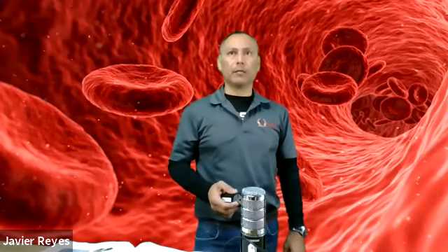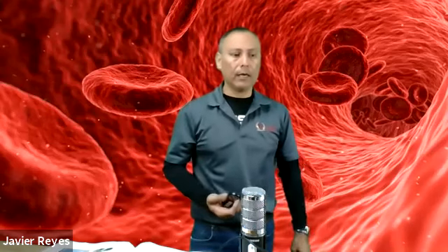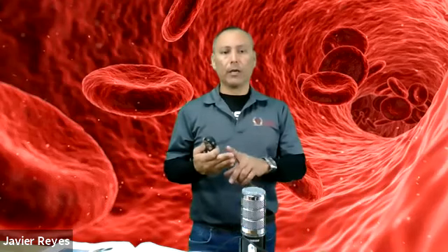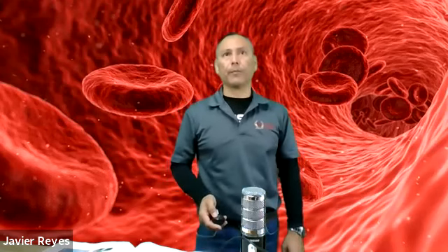And label your specimens in front of the patient at the bedside and observe any special handling. Does your specimen need to be put on ice? Does it need to be covered from light, protect from light? Does it need to be kept in a warm block, etc.? So make sure that you follow the specimen handling instructions, and we'll discuss that in another chapter.